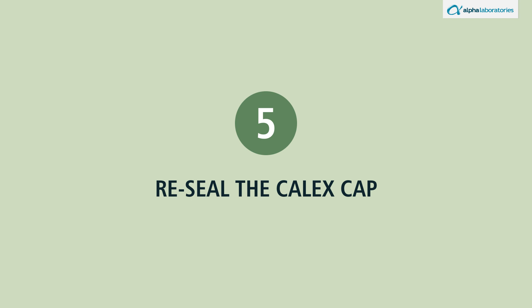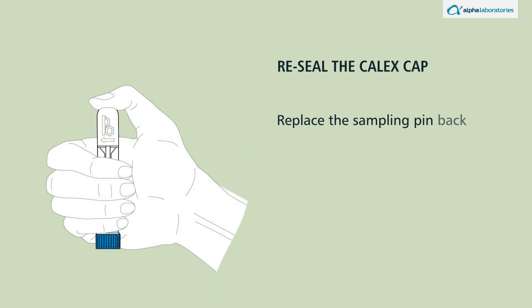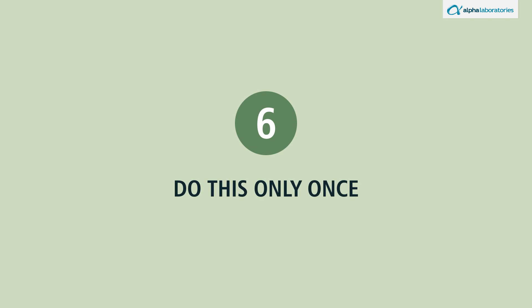Reseal the CALEX cap. Replace the sampling pin back into the CALEX tube and push firmly into the locking position. You will feel and hear two clicks. Do this only once.